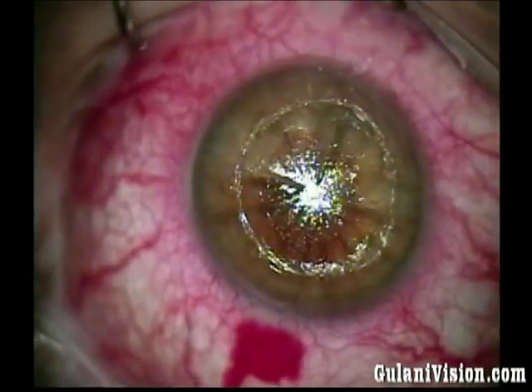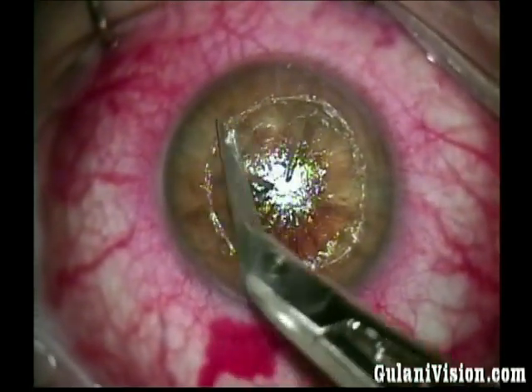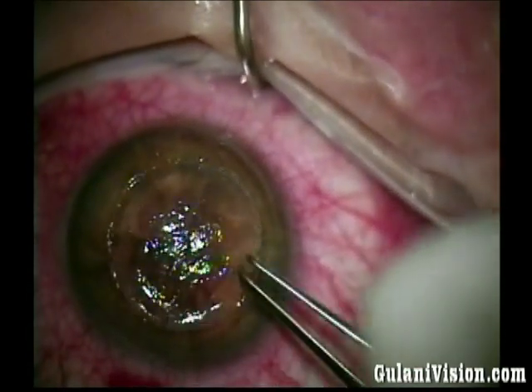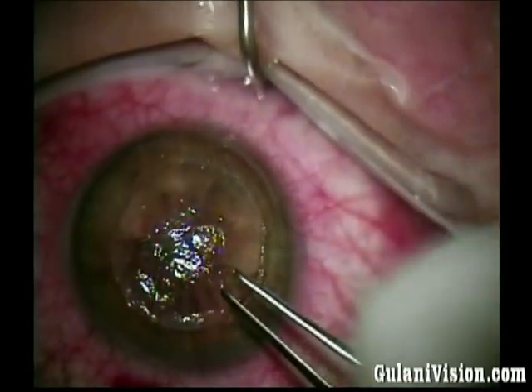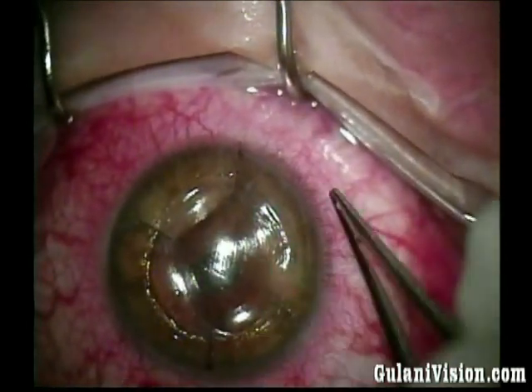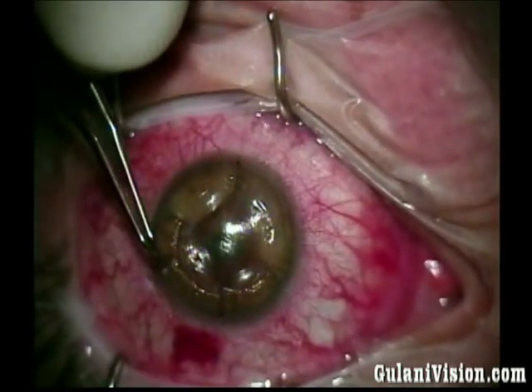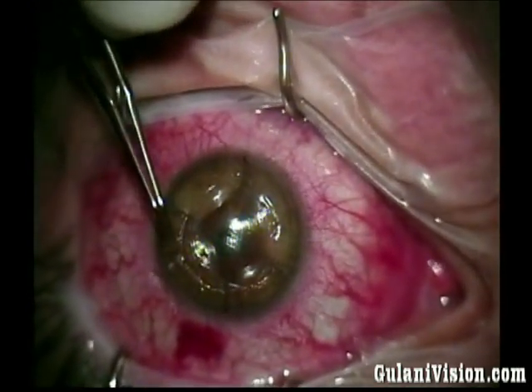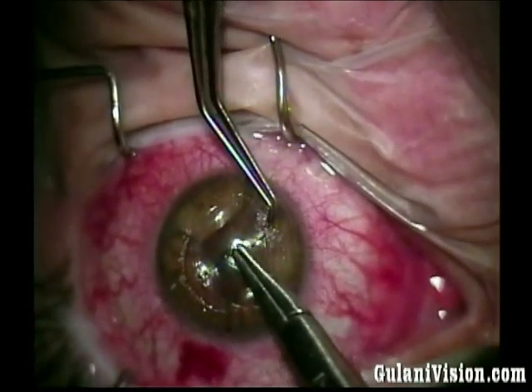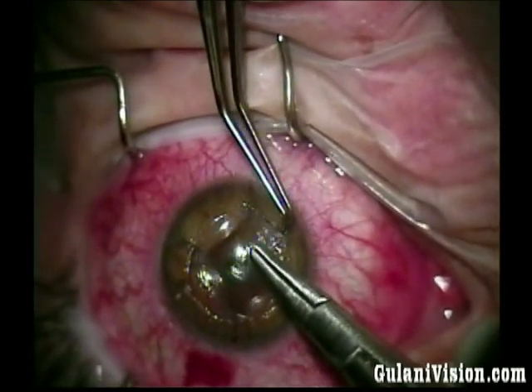Remove the excessive sliver. This is the ectatic area with very deep incisions. I'm now laying the donor tissue on the recipient bed, making sure it fits well. I now proceed with my anchor sutures, and the problem I have here is I cannot go radial because there are all these RK and arcuate cuts everywhere. So I'm planning as I can go obliquely across, and I take 2 additional sutures to counterbalance the ectatic area.